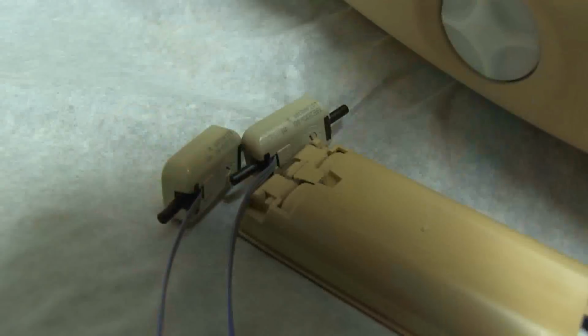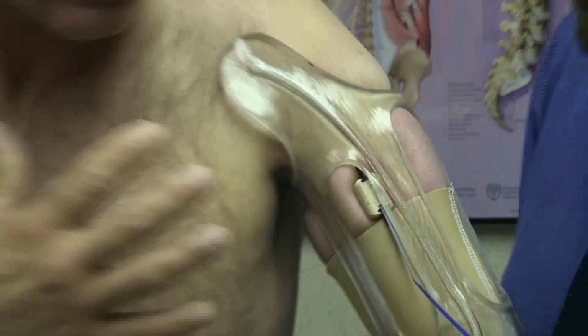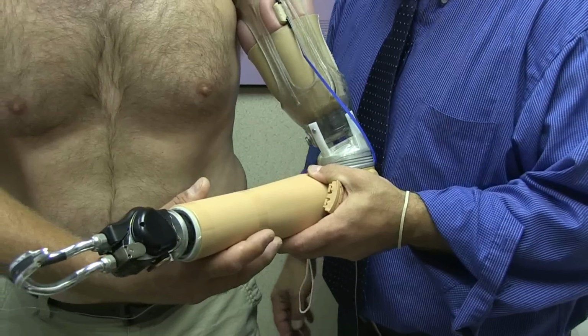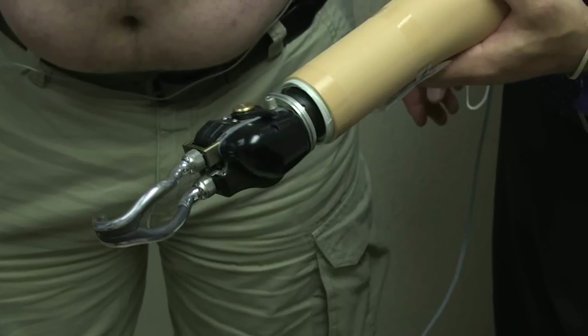So he can control both functions, i.e. opening up the terminal device and pronating and supinating the terminal device with the use of two surface electrodes, one positioned over the bicep, the other over the tricep muscles, and he also has another control where he can co-contract two muscle signals, firing two muscles at the same time, in order to switch the hand function to the wrist and the wrist back to the hand.